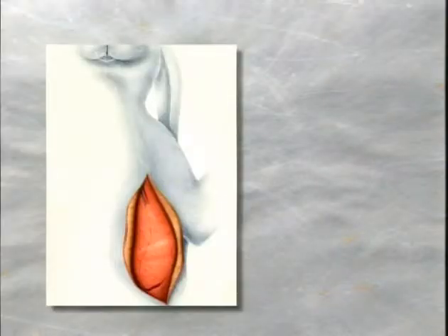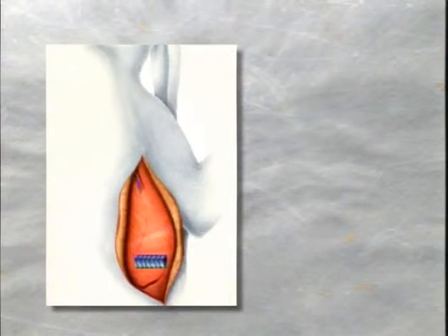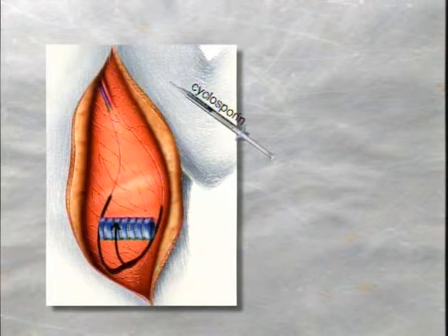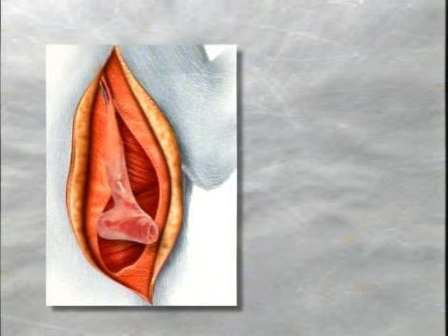A much better way for revascularization is the indirect heterotopical position. For heterotopical revascularization, the tracheal allograft is transplanted to the lateral thoracic area of a receptor animal. The fascia is wrapped around the transplant in an immunosuppressed animal, receiving daily administration of cyclosporin. The transplant can become revascularized in an immobilized position after closure of the lateral thoracic skin.